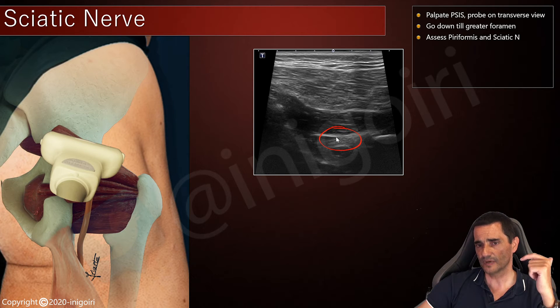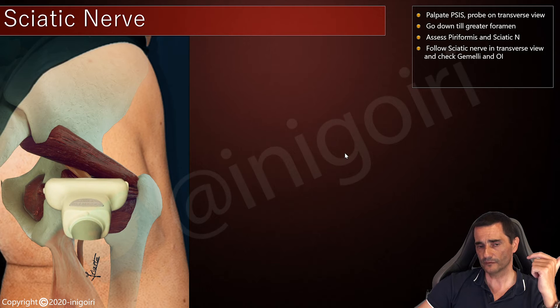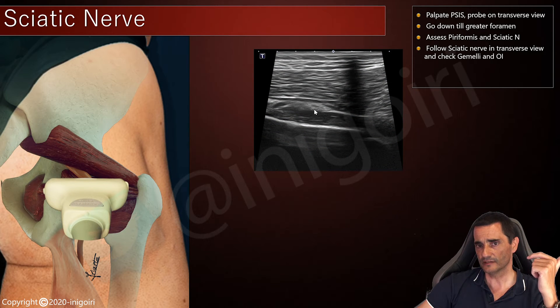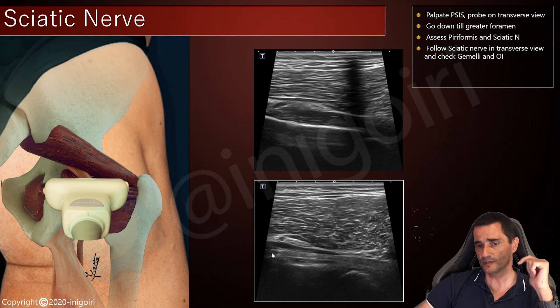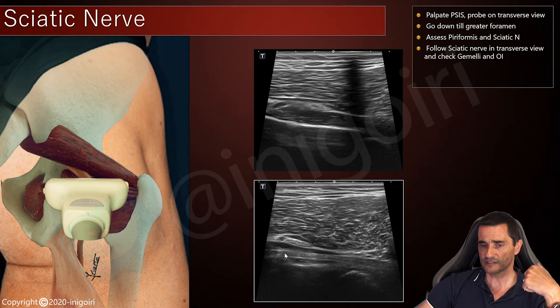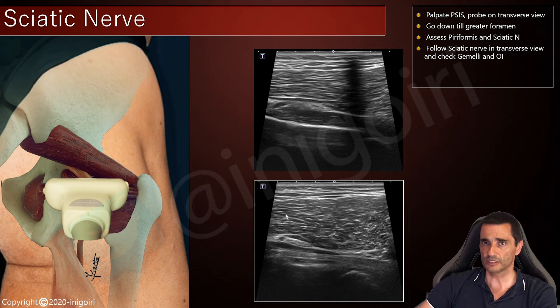It is difficult to find the sciatic nerve here, but we know it should be located here, so as we go distal, we will focus on this area and see how this hypoechoic image underneath a muscle will be located above the following muscle — the superior gemelus — and this will be the sciatic nerve. As we go distal, we notice the following muscle, which will be the obturator internus, very characteristic with this thick tendon inside. You can see the sciatic nerve with a good image using this linear probe — this patient is young, healthy, a sports-related patient — so it's easy to see, but in other types of patients we may use the convex probe.